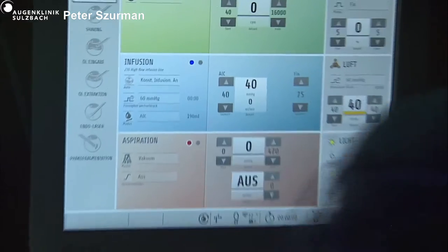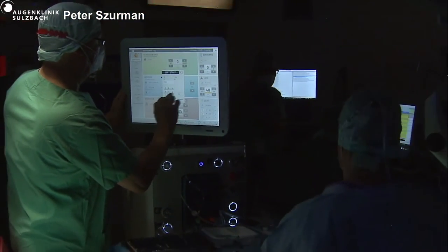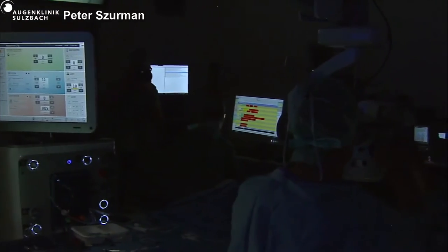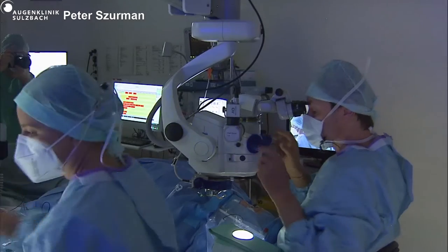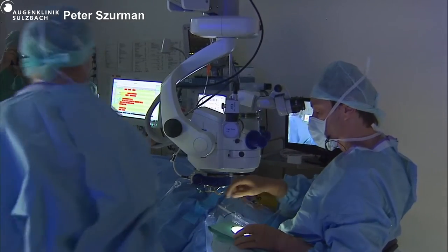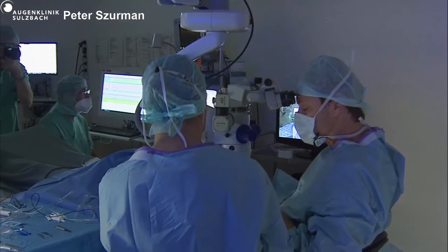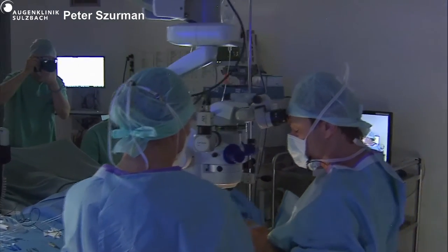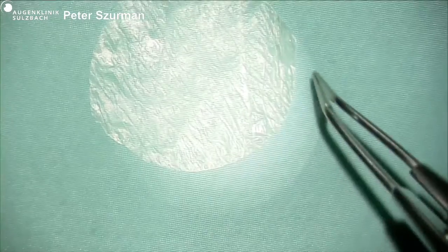Air down to 10. Amnion. So you said epimacular amniotic patch. Exactly. Most amniotic patches that I have seen have been subretinal, whereas the autologous retinal grafts have been either subretinal or superficial. So I think this is something new for me.